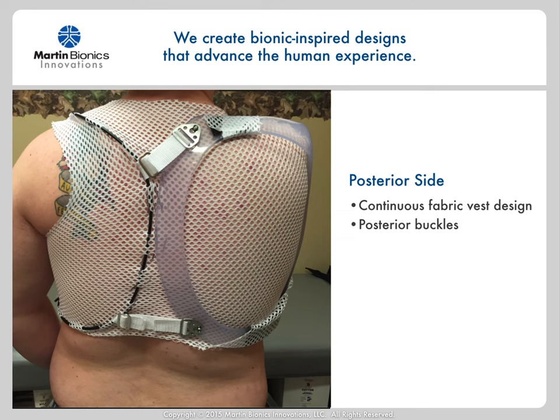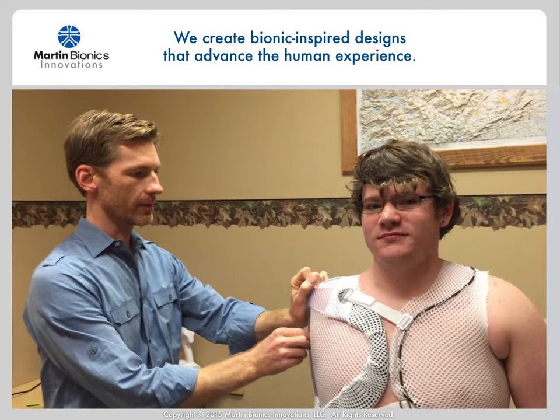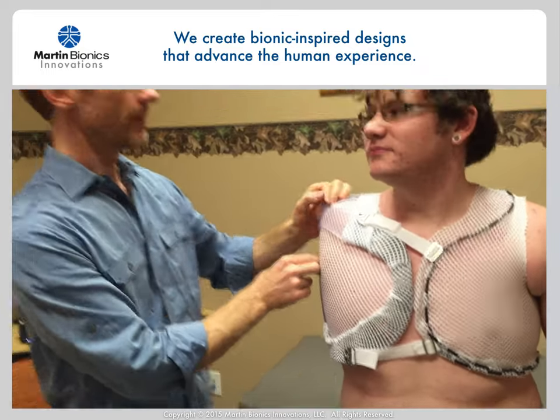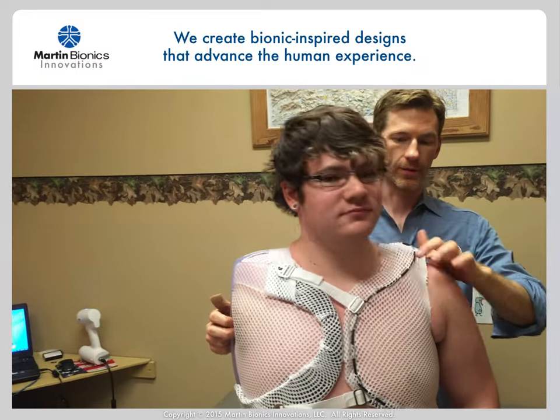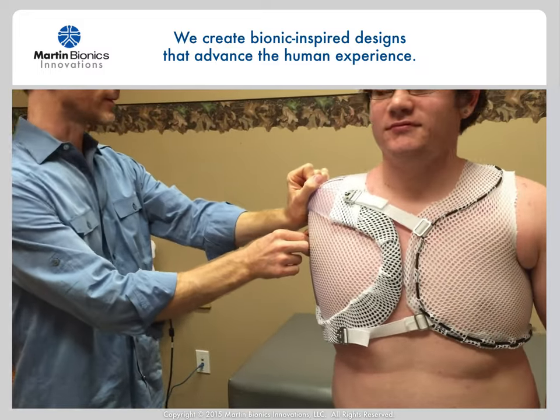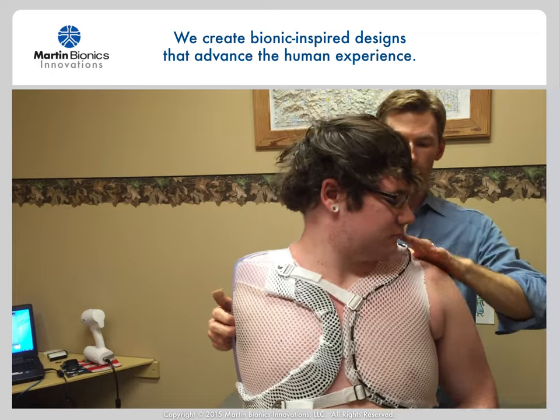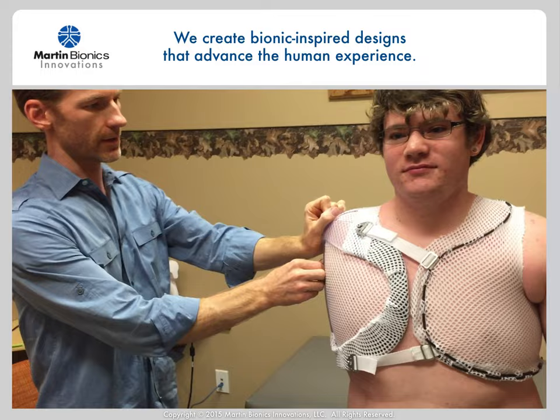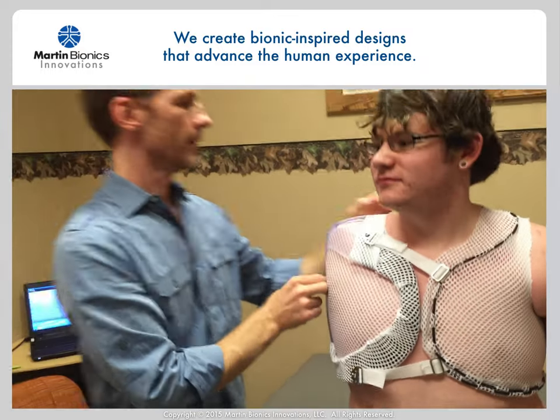On the posterior side of the socket, you can see how the fabric remains as one continuous piece, similar to a vest pattern. We also used a pair of buckles on the posterior side to connect the stabilizing unit to the force distribution cable. Here you can see how well the socket holds onto the user. The socket is really not very tight on him at all, and by spreading the forces so broadly, we can achieve an incredibly solid lock without having to have a very tight socket. The cable directs the forces very specifically, allowing for sensitive areas to have minimal force, such as over the tops of the shoulders. This design eliminates any migration of the fabric onto the user's sound side neck or axilla areas — both areas can remain comfortably loose.